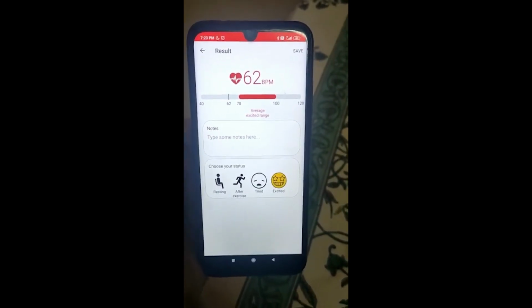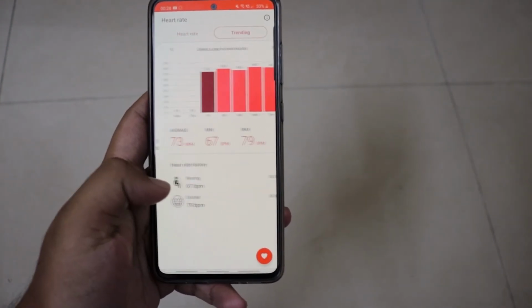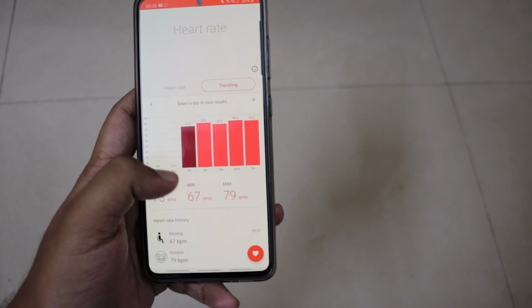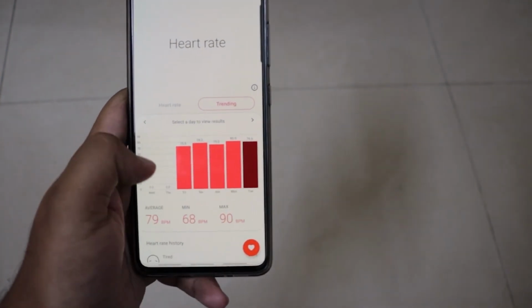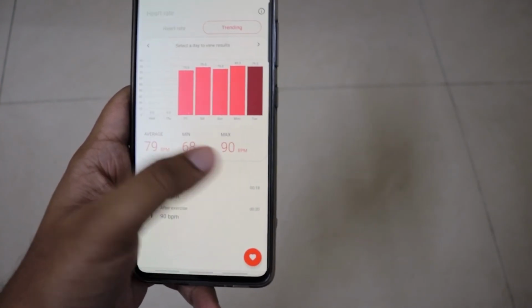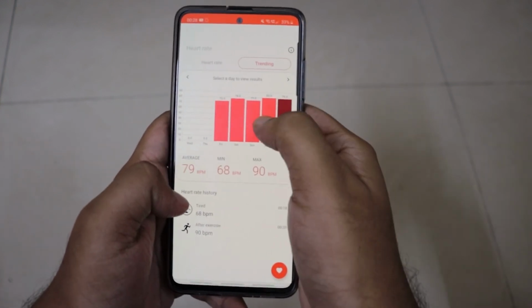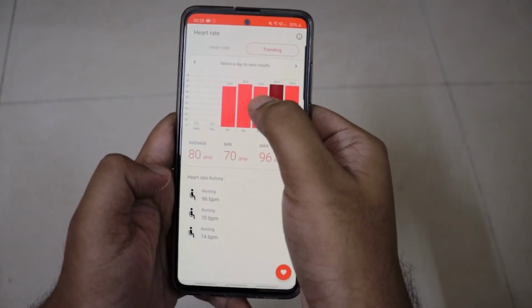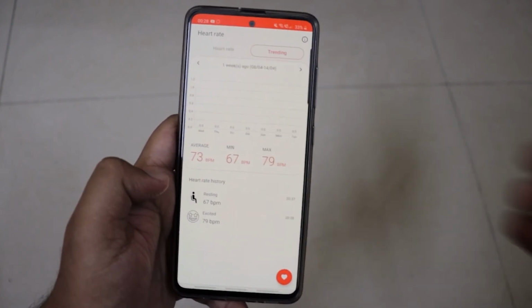Now that you have recorded the heart rate, you can go to the trending section and see all the heart rate activity you have done so far. So for today I have recorded these two activities, and I can see the maximum and minimum value, and we can see the average value. In the graph we can see the average value as well. For different days we can click on the graph and check on different days, and we can go back in different weeks as well.